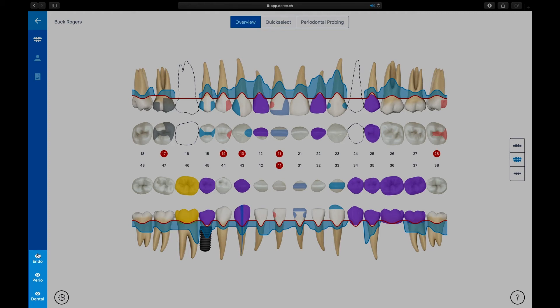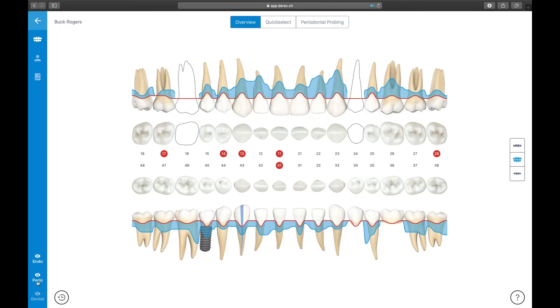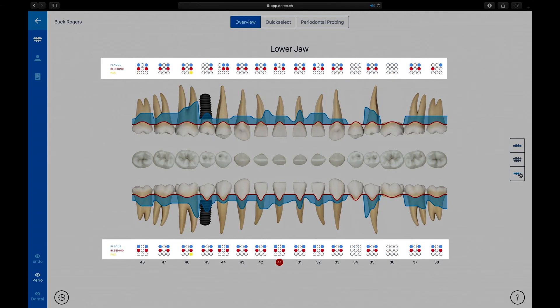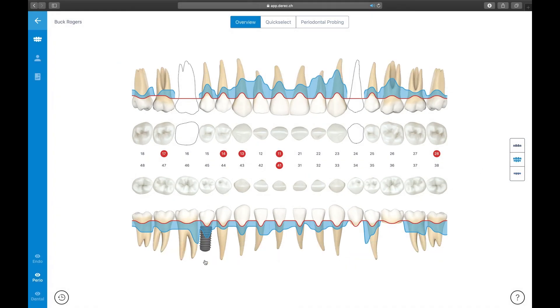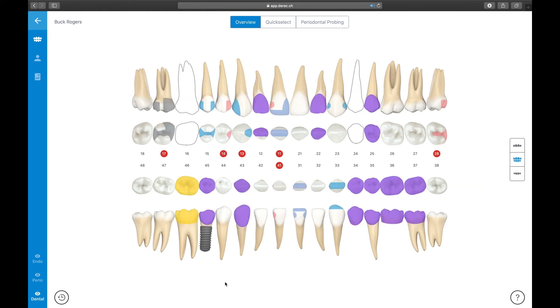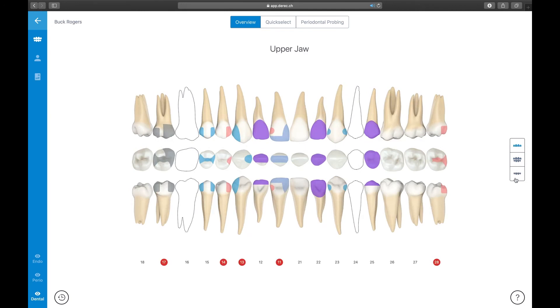All three chart views can be filtered by the main three oral tissues in Derek: the dental, the periodontal, and endodontic findings. The filtering buttons are located on the bottom-left portion of the screen. For example, by deselecting Dental and Endo, Derek will only show the periodontal findings, and you can focus your discussion so that your patient can understand his situation. In the upper and lower jaw view, you can also see the plaque, bleeding, and pus active sites on the teeth — a great way of demonstrating to the patient how inflamed his gum is and where he needs to perform better oral hygiene.